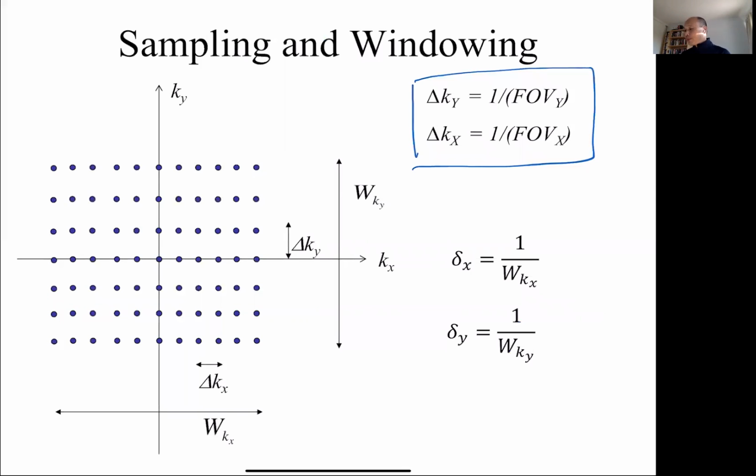The other thing that you'll typically determine is the resolution, right? You want to determine some resolution. And this resolution is also related to the effective width. That's the smallest sampling cell that you can consider in your image. And so that is simply 1 over the width.